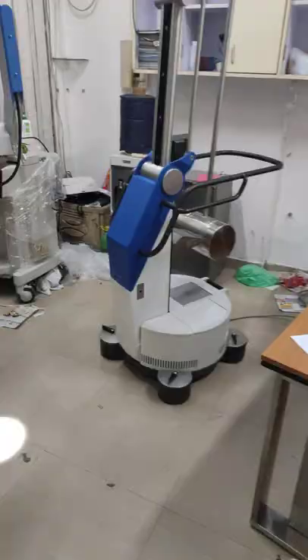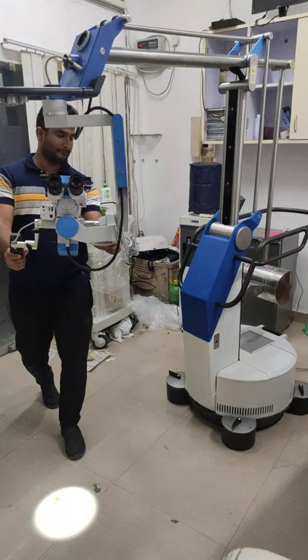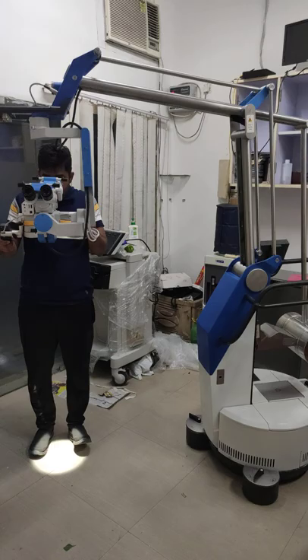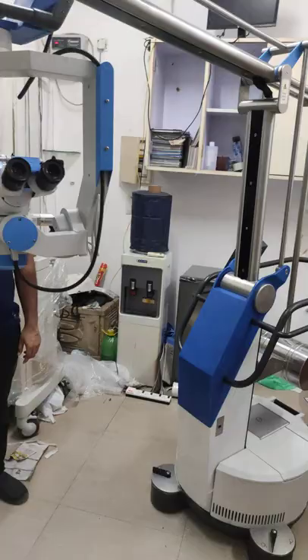Look at the movement of the stand — how smoothly it is moving. Single-handedly you can operate the complete microscope. You don't need anyone else to operate this.